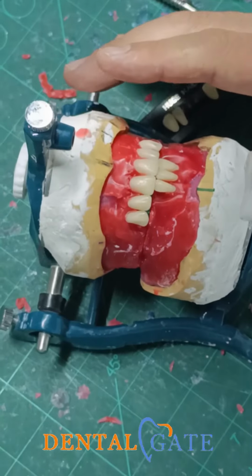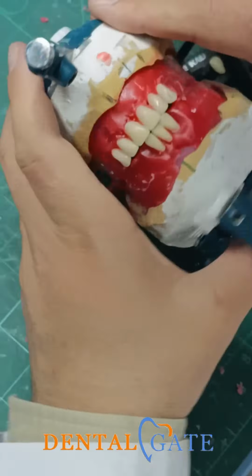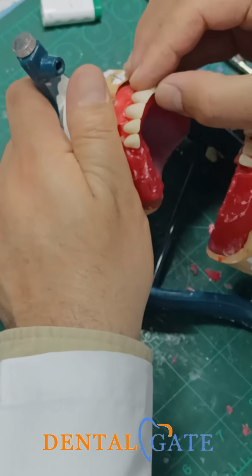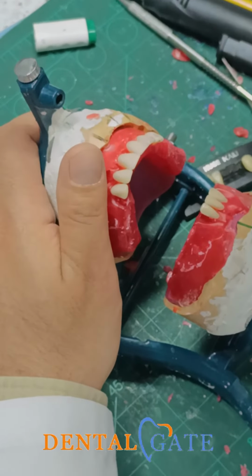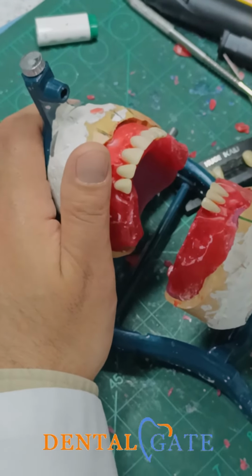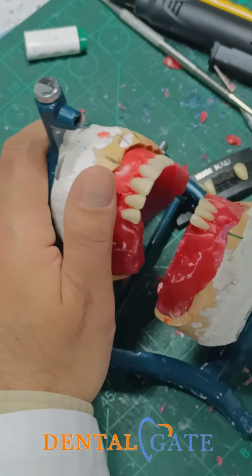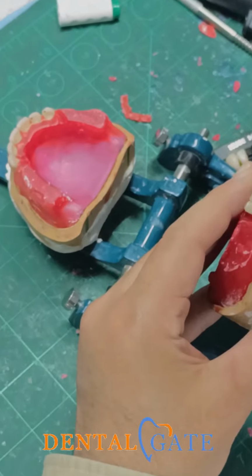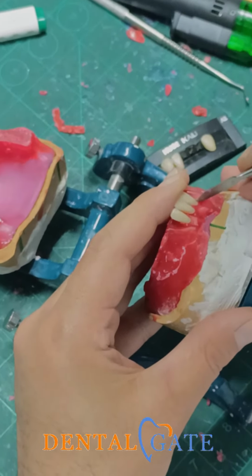Yes, because my objective is just upon the table, and I can make a proclination here. It will be produced by the residual stress in the wax. If you leave it, the teeth will change within the residual stress. Why not change the lower, for example? For what? For making the space for the overjet.